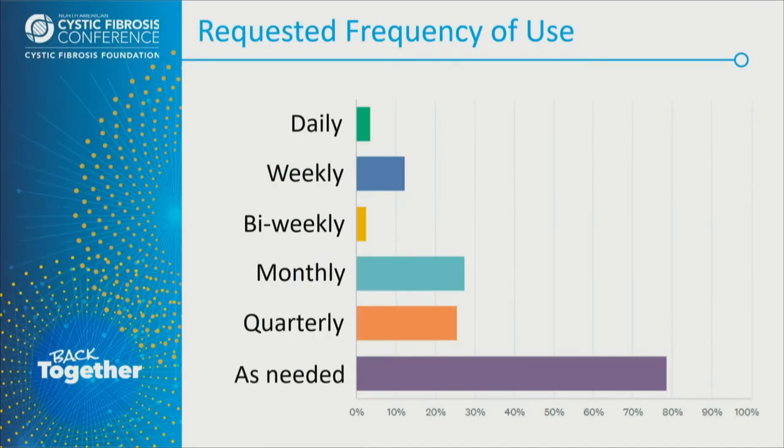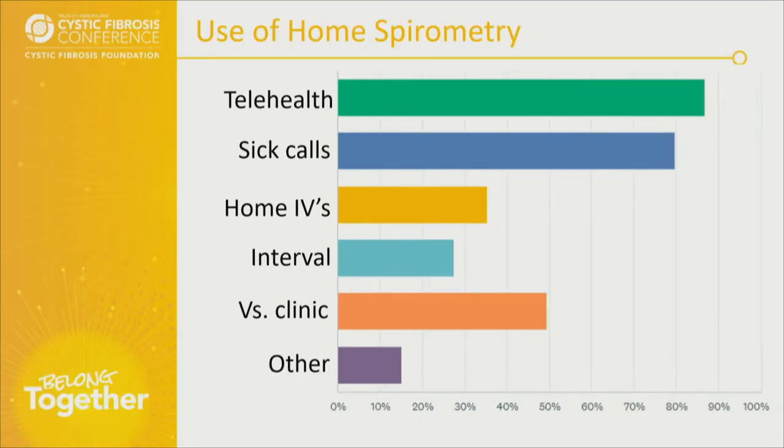And so we wanted to know, how often are you asking your patients to do this? You can see fairly common for monthly, quarterly, certainly most common when there was a need that would arise, people would go ahead and use it at those times, but there were other intervals as well. And then we wanted to understand, how are you using it? So you can see most people used it for telehealth. Sick calls, it's obviously helpful and important there as well. You can monitor how people were doing on their home IVs.